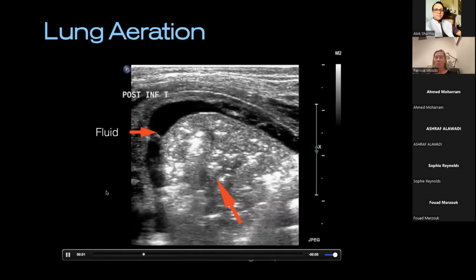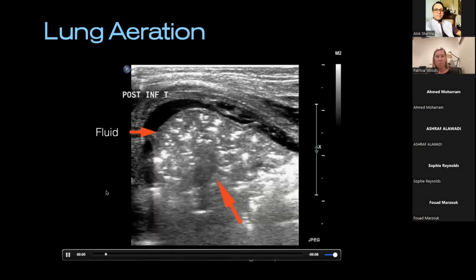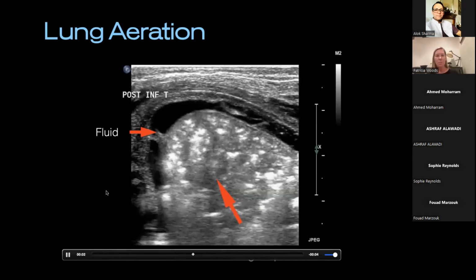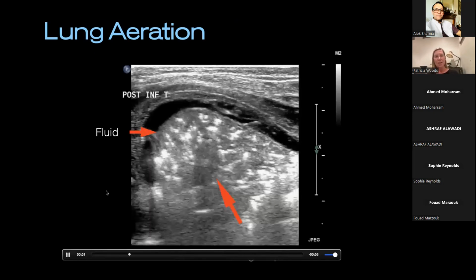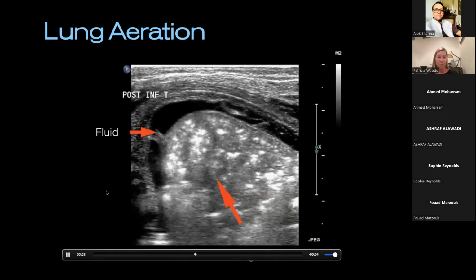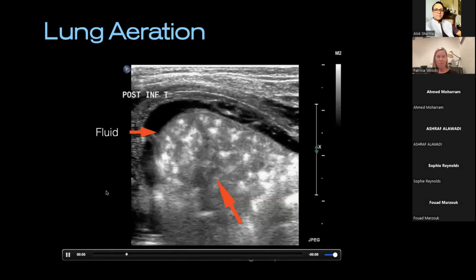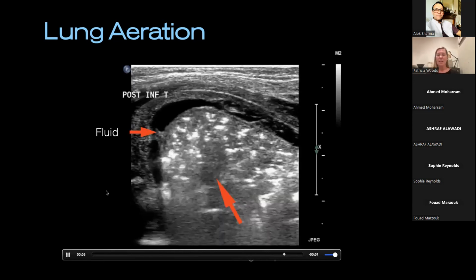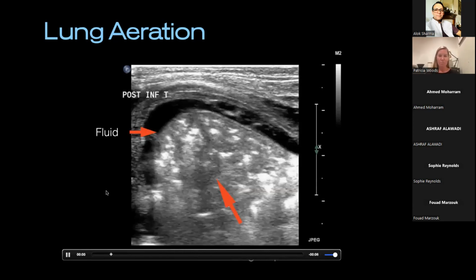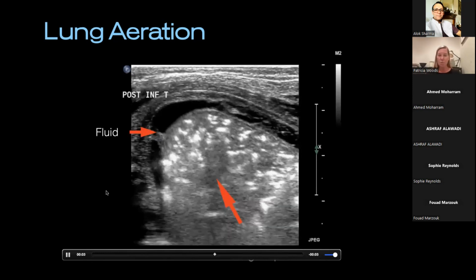So that helps you. And I think what I'm observing here is a nice, thick, meaty chest wall in between a rib space for most of it. And I've got this little lung that's suspended in this anechoic fluid. I've probably got fibrin strands and stuff there, probably been there for a while. But more importantly, if what, so what? Look at the lung underneath. Okay, I've probably gone over my marker there. So what can you observe with that lung?